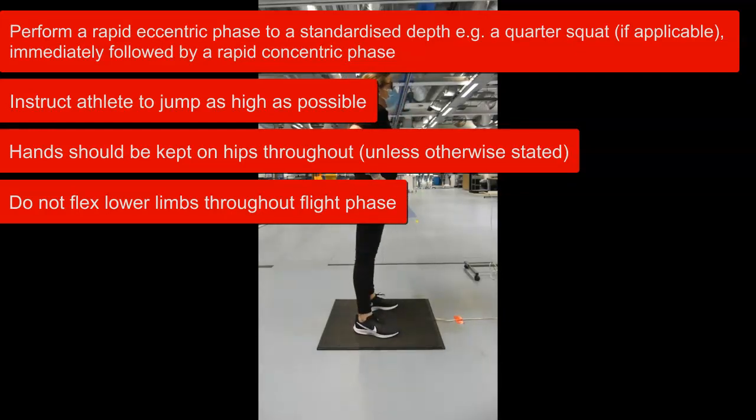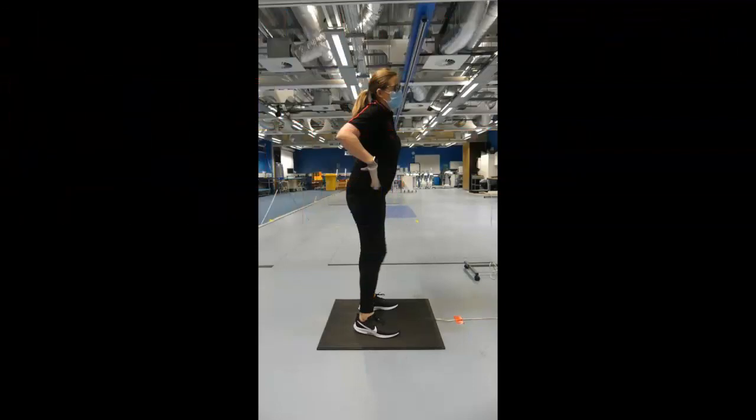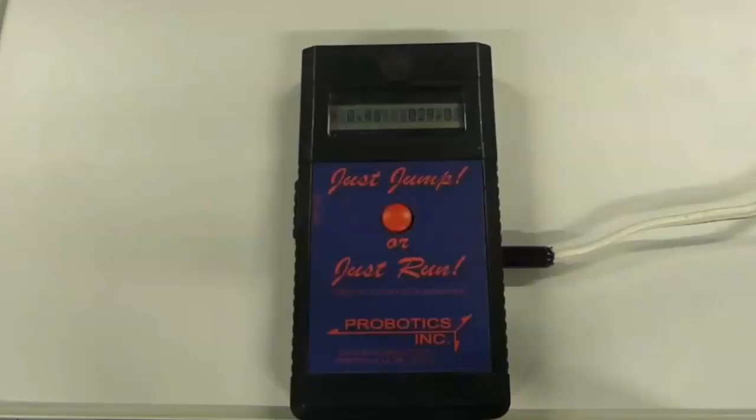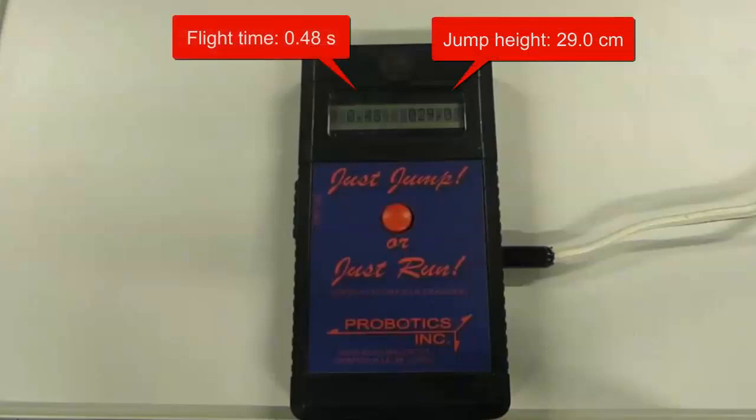If you need to repeat, the athlete doesn't need to step off the jump mat — they can simply perform their jump again and the unit will provide the updated results. As you can see, the handheld automatically provided two values: on the left is flight time in seconds, and on the right is jump height in centimetres.